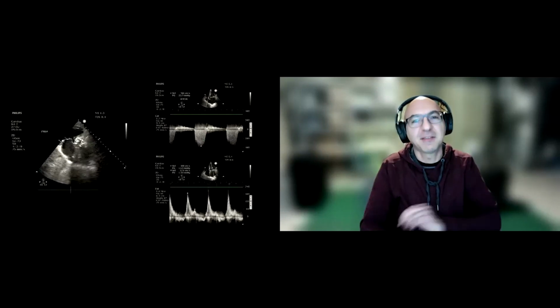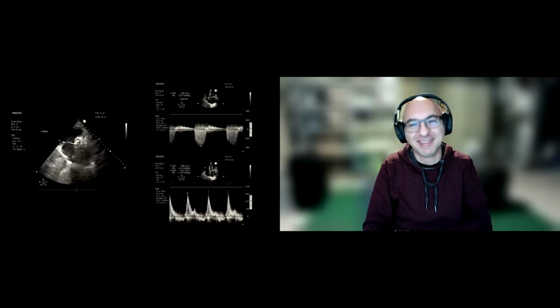All right, you ready for the big one? Sure. The big teaser here. So we talked about all this, the aortic stenosis, they're very preload dependent. We talked about all the preloading conditions at every step down the way: the LV, LA, pulmonary vasculature, RV, RA, IVC. We hit all of that today.